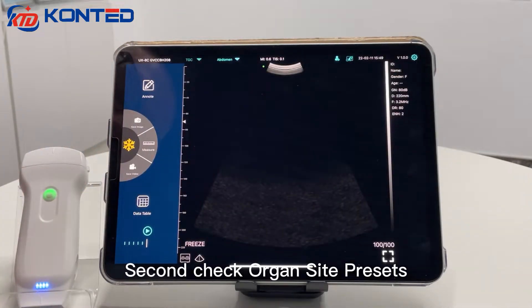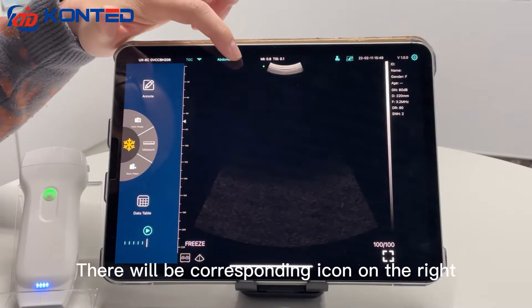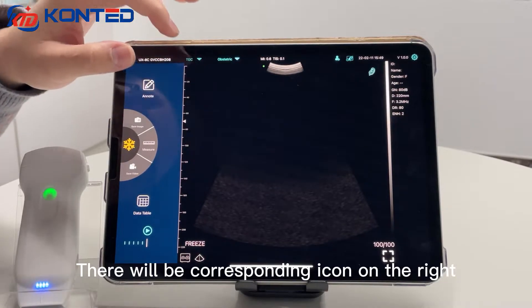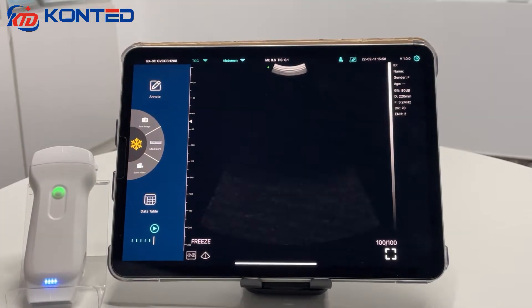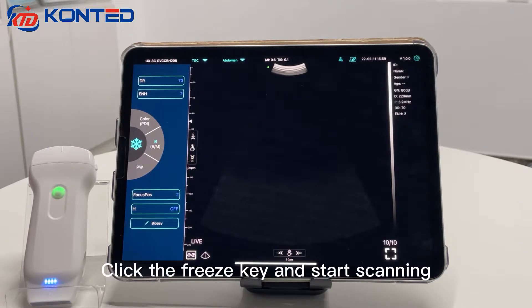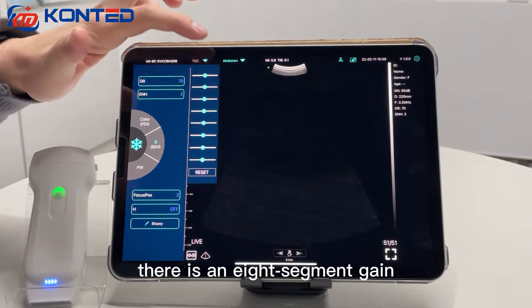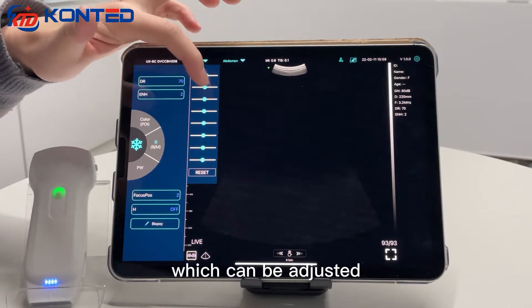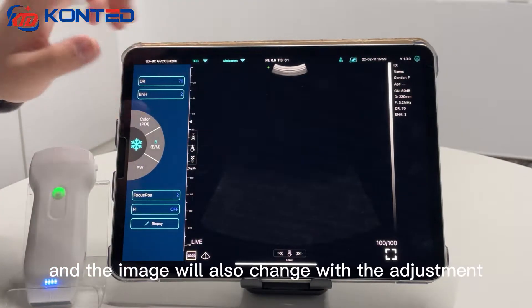Second, check all preset places. There will be a corresponding icon on the right. Click the freeze key and start scanning. There is an 8-segment gain which can be adjusted, and the image will also change with the adjustment.